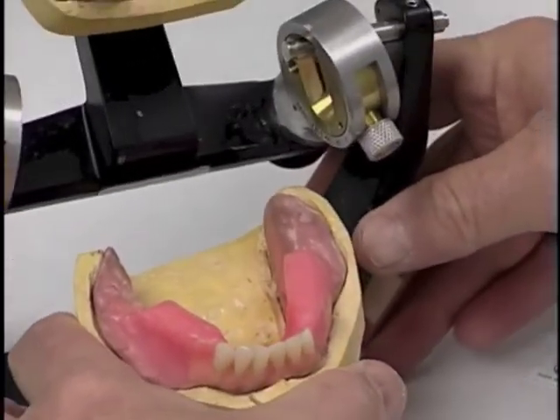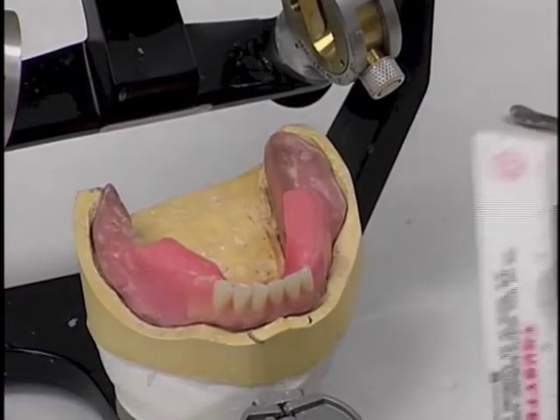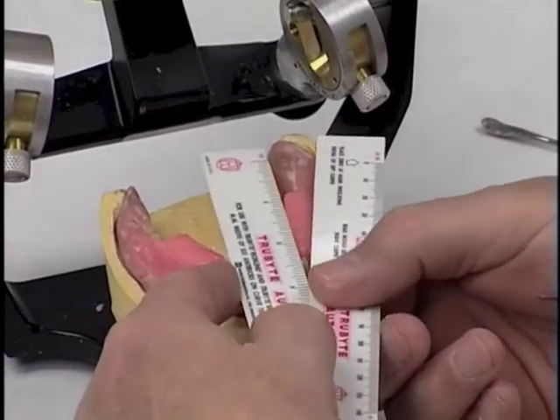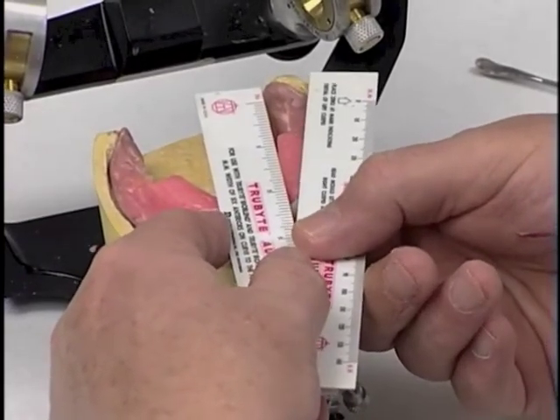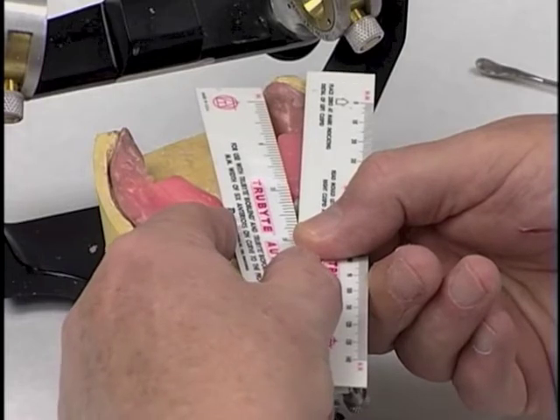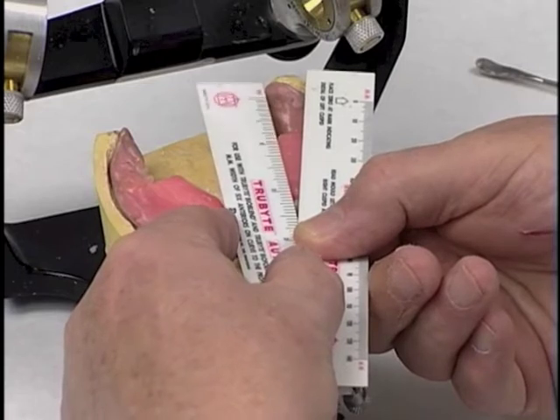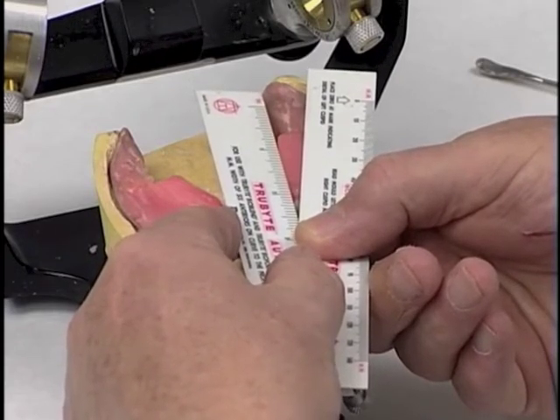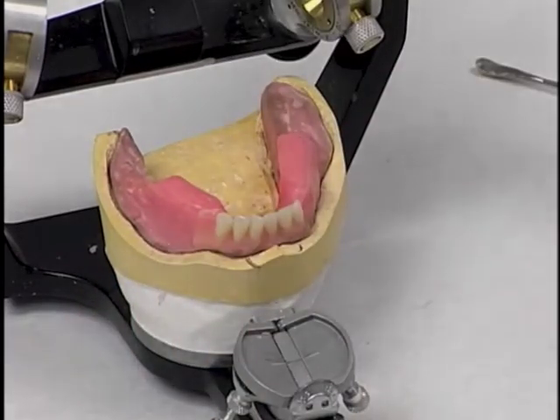Another neat thing that we can do, and we'll check this out after we're finished with the arrangement, is that if we form a triangle between the lateral and medial parts of the retromolar pad, with the apex of the triangle being out where the canine is, then the majority of all the occlusal surfaces of that mandibular arrangement of teeth should fit within that triangle, as we see it right there. So after we're finished with the arrangement, we'll check and see if that came out that way.